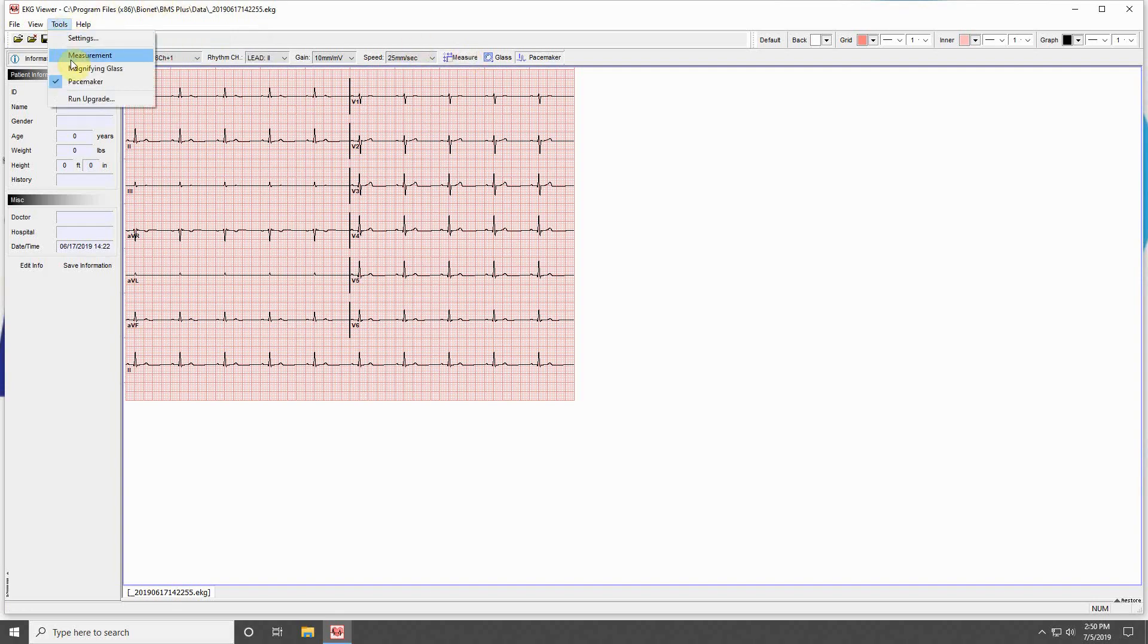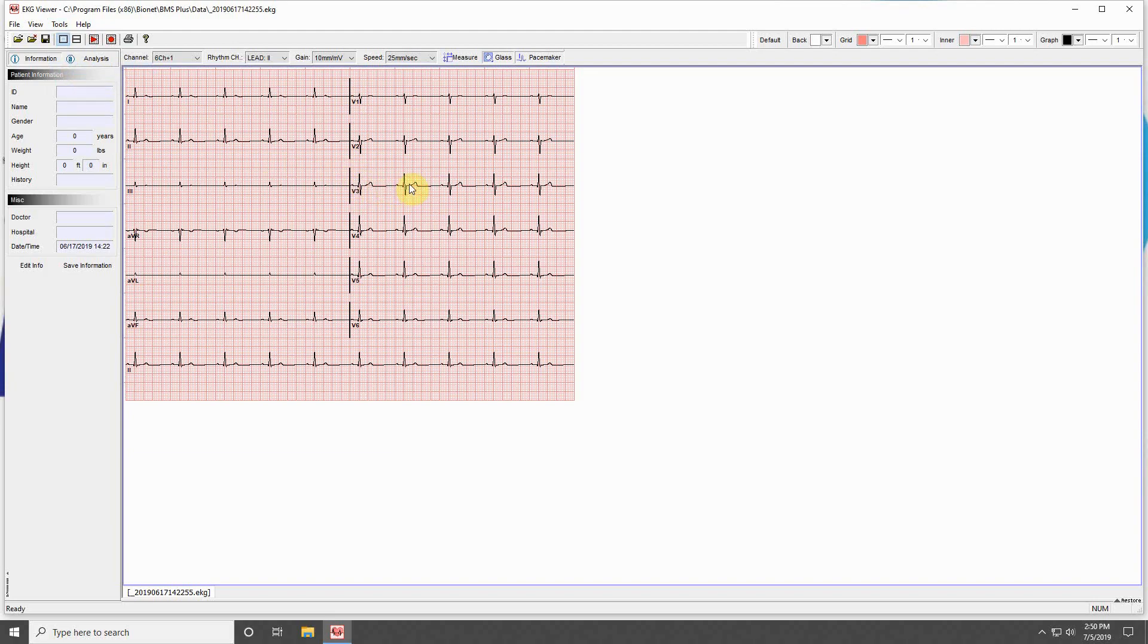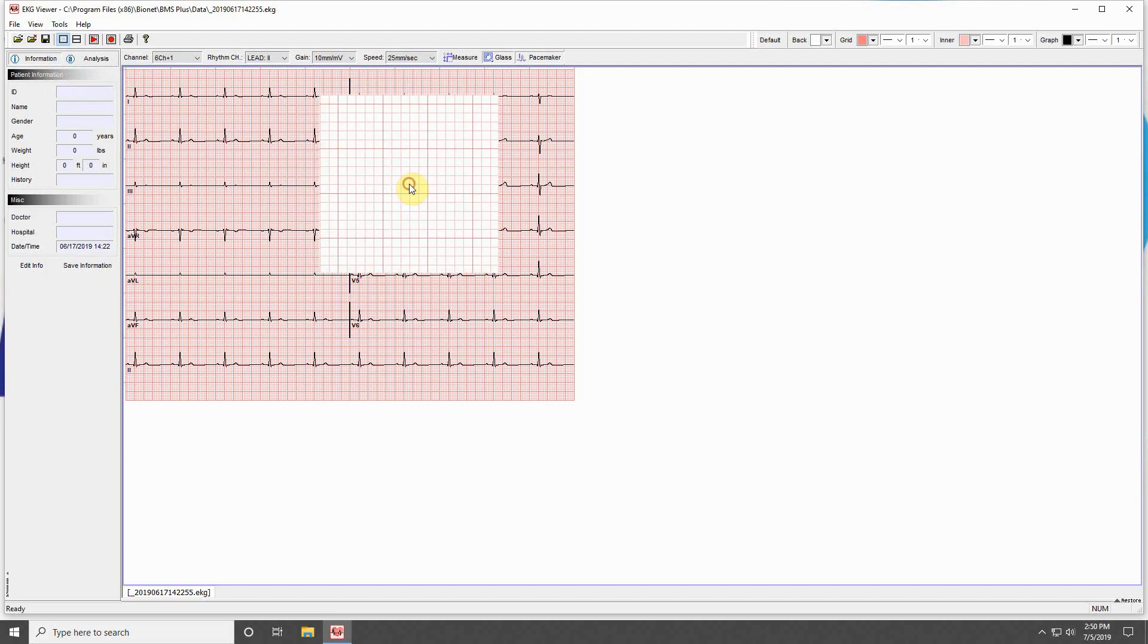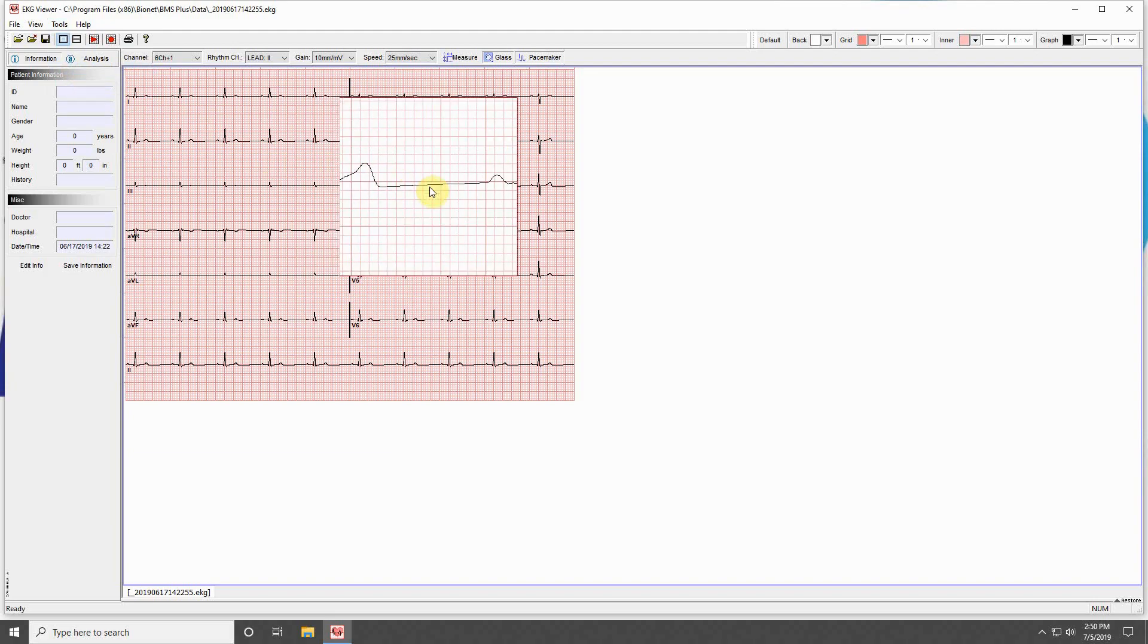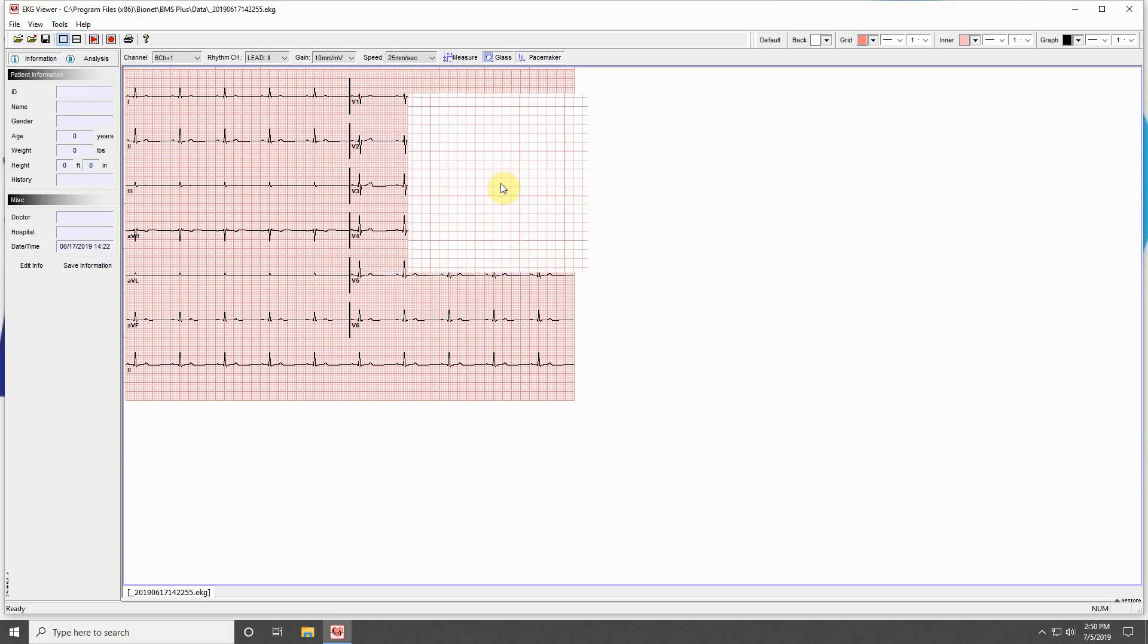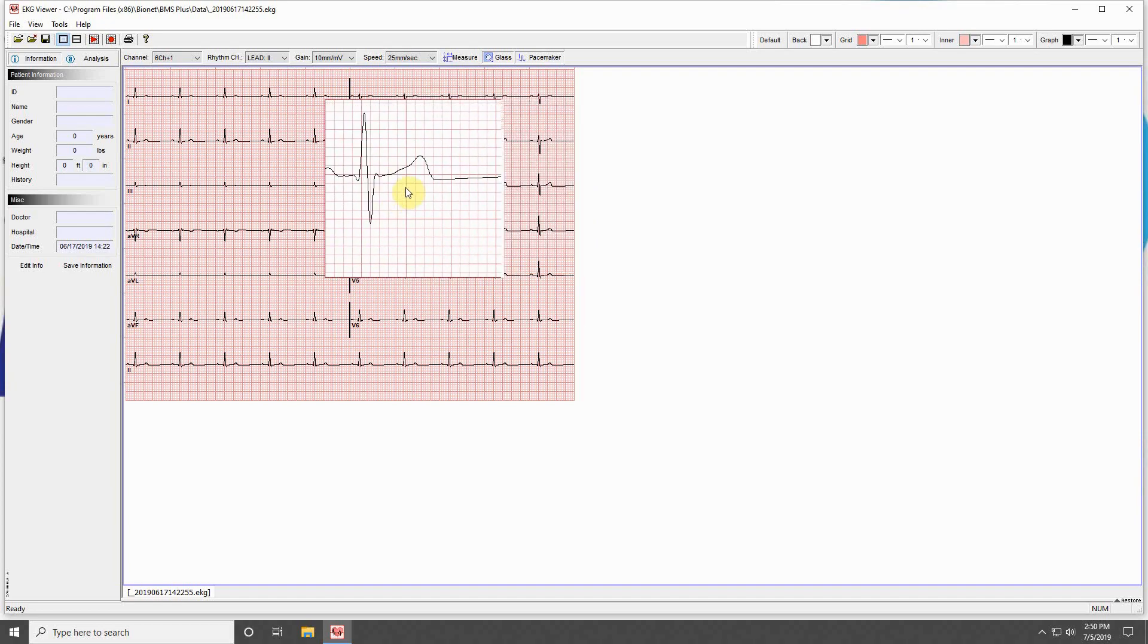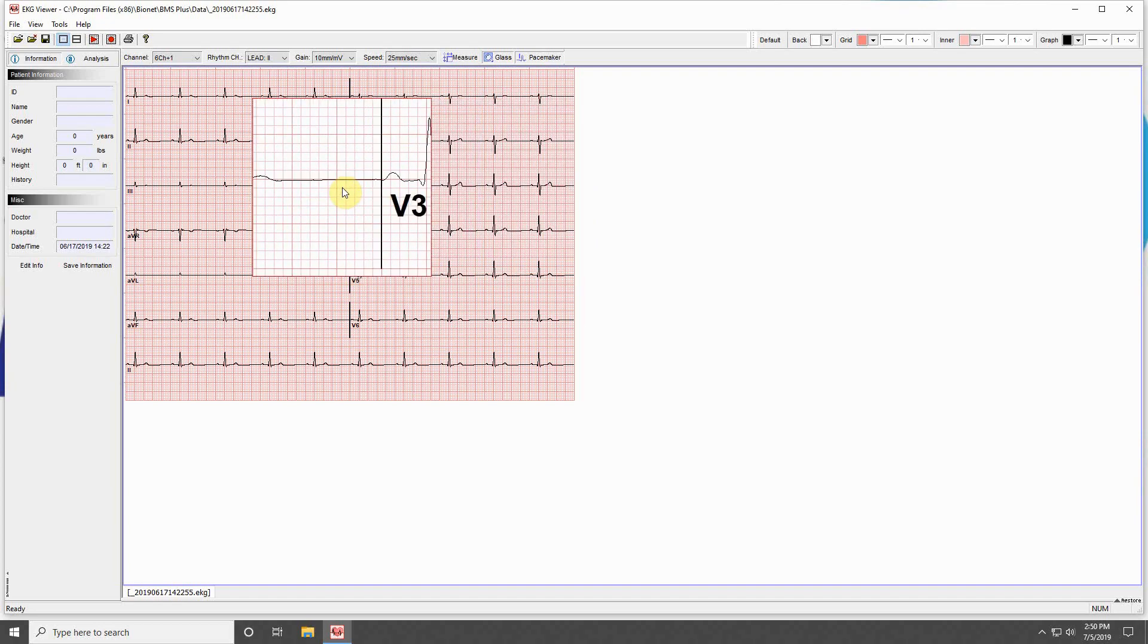The next tool is the Magnifying Glass tool, which allows you to zoom in on a selected section of the ECG. Simply hold down the left mouse button and scan across the ECG to get a close look at it.